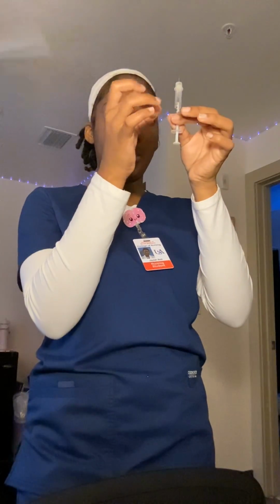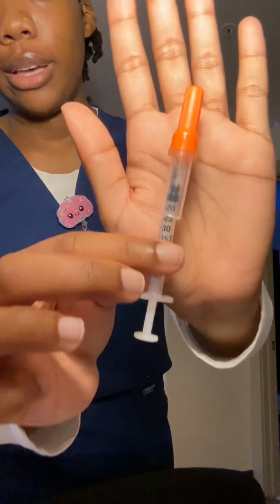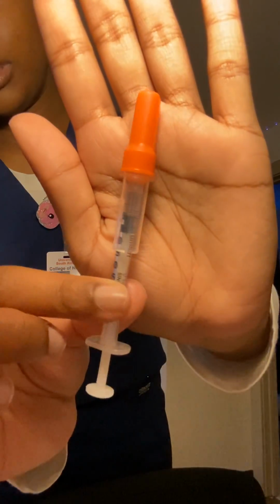Get these little air bubbles out. Okay, now I'm just going to scoop the top back on for safety. Now I can show y'all I do have 10 units of insulin in here.